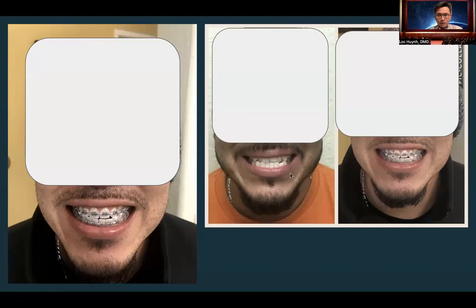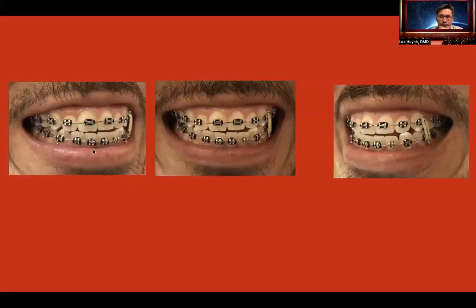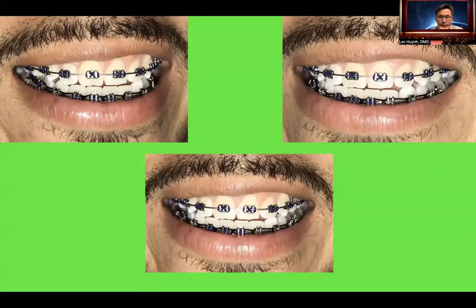Just a few months in, you can see the bite looks better. Look at how we were able to move the laterals out on both sides, and we slowly moved 8 and 9 away from edge-to-edge grinding. We used elastics to pull the tip down over several visits, continuing to align. The idea is to make the lower arch slightly smaller than the upper arch, so we can achieve a Class I or slight overjet — that would be ideal.